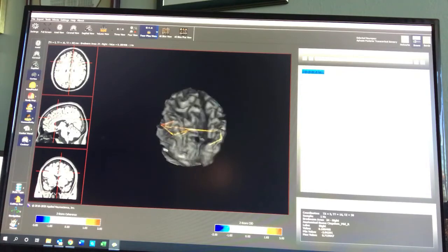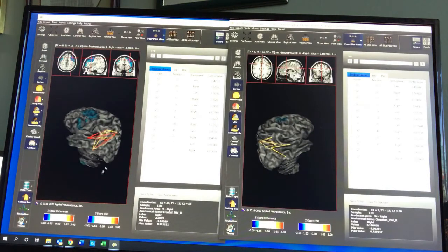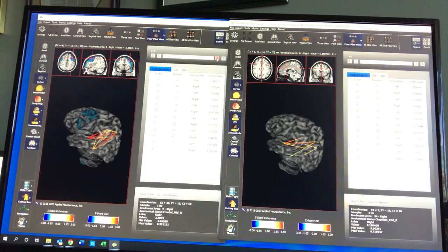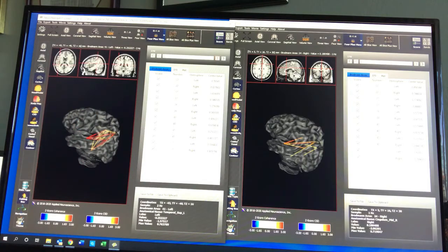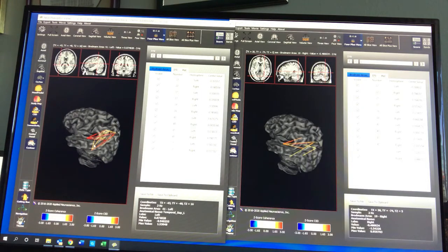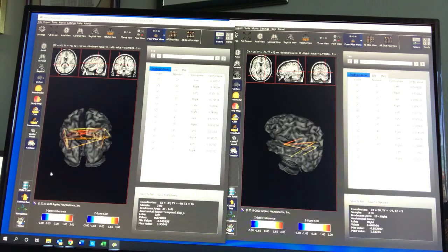But let's go on and look a little bit further at some different images at different frequencies. So this is at 1 hertz. Let's just keep both images up here for now, and we will look at the images going up through her problem. So here's 1 hertz, and here's what's going on at 2 hertz baseline, and this is 2 hertz after 10 sessions. Again, a lot better. 3 hertz, still a great deal of problem. 3 hertz delta, still a lot more efficient than it was before. We can see that efficiency has increased a great deal.